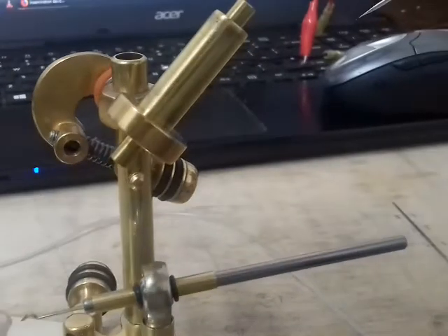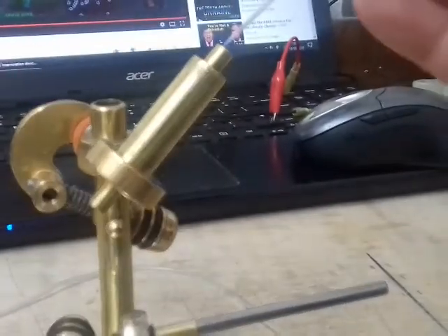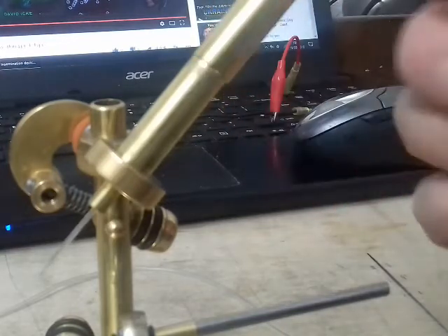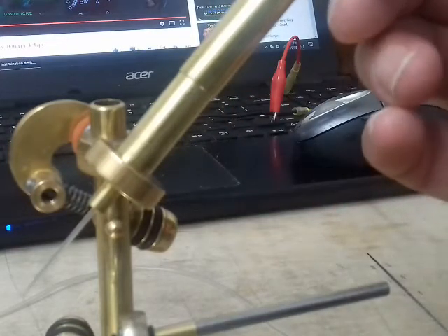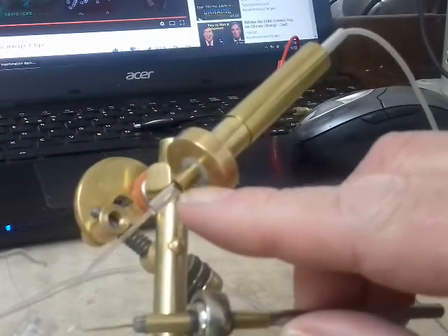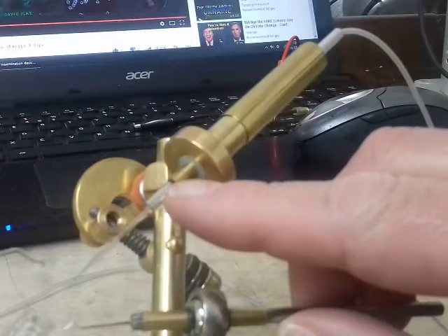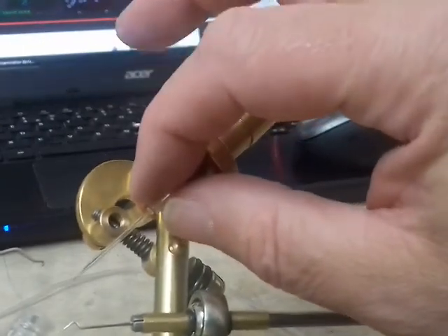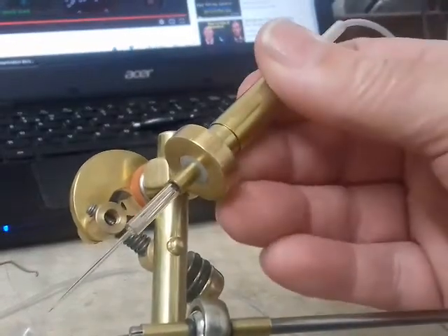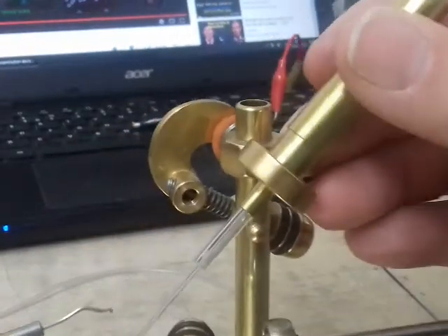So that one just fits inside there, inside that tube. Now the outer glass needle is a really precision fit in the inside tube here, because I've rounded the end over there slightly, so that needle has absolutely no play whatsoever, but it will move in and out, you know, comfortably.